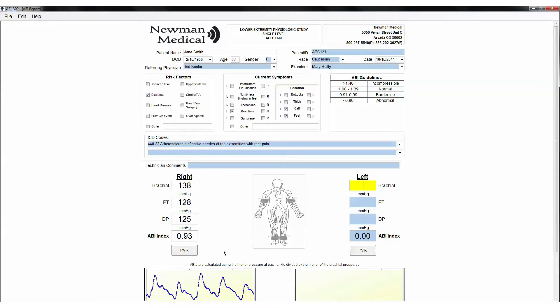If satisfied, deflate the cuff and move the aneroid to the left arm and press Tab or use the cursor to move to the left brachial site on the computer. Repeat the sequence you just completed on the patient for their left side.